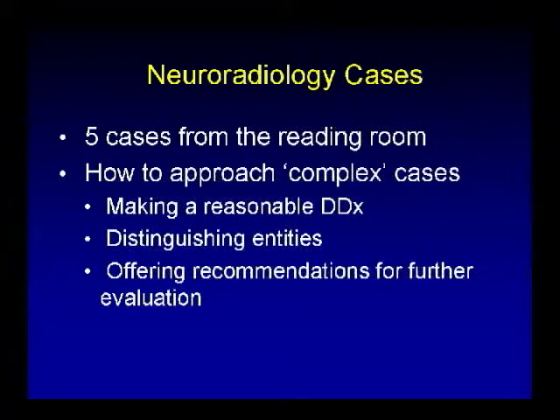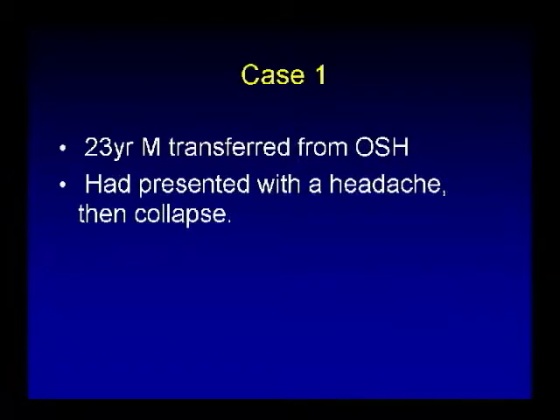before they come up with a differential diagnosis. If you shoot from the hip, say, oh, this is an X or a Y, without explaining what it is you're seeing on the films, and you're way off, you just look stupid, and it's very hard for your examiner to pull you back to where they want you to get towards the right answer. So the first one we're going to start with is a young man who was transferred from another hospital who presented with a headache and collapse.